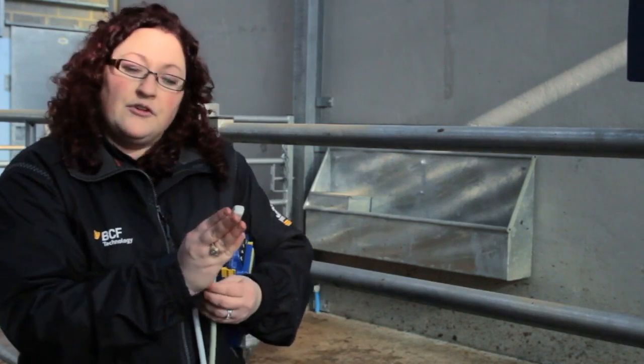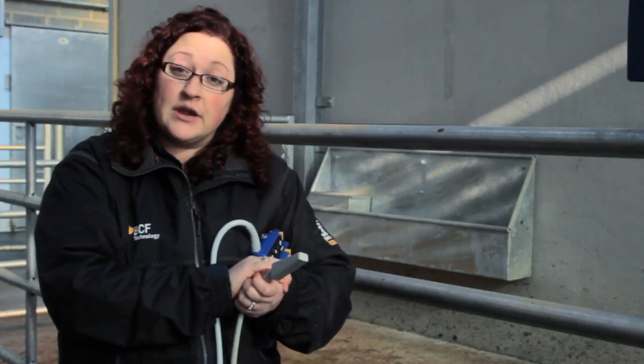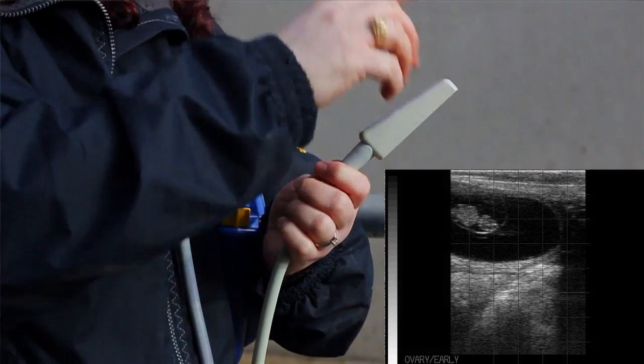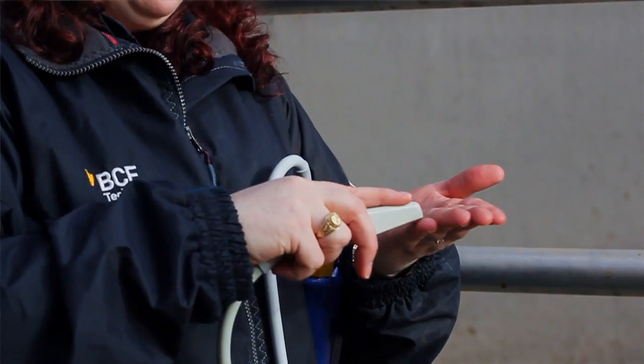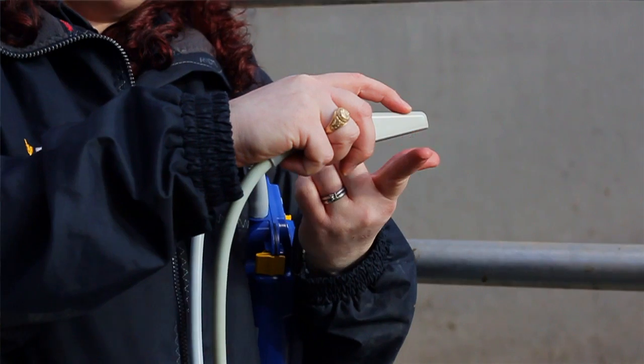Therefore, you need to understand how to hold the probe to get the best possible image of whatever you're wanting to look at within the cow. A few features to recognize are where the tip is and how that relates to what you're actually seeing on the screen. On this particular machine, the tip is located to the left side of the screen. So as you move forward or backwards within the cow, anything on the left side of the screen corresponds to the tip of the probe.